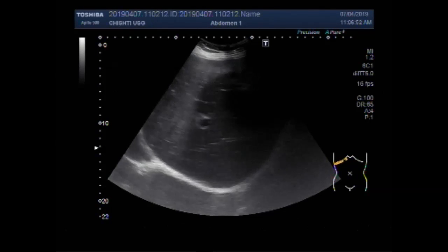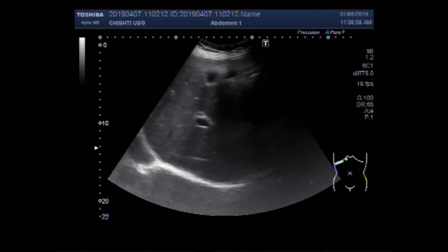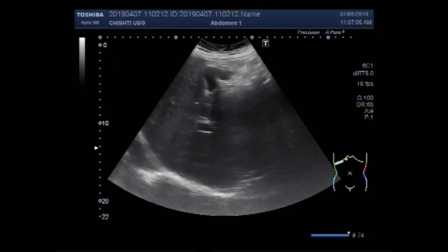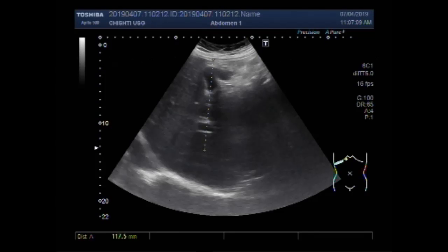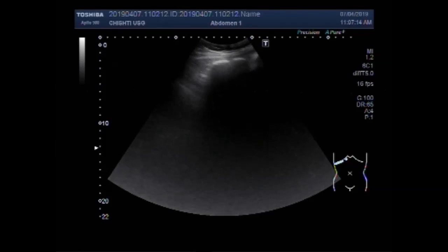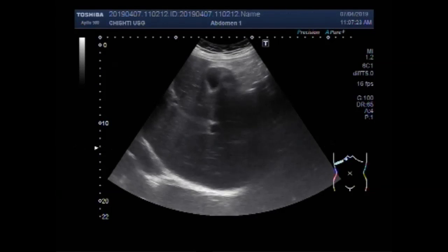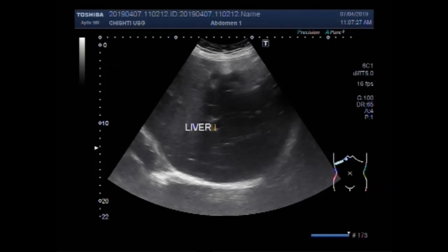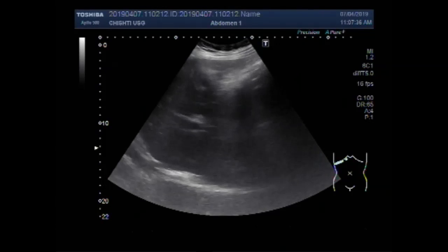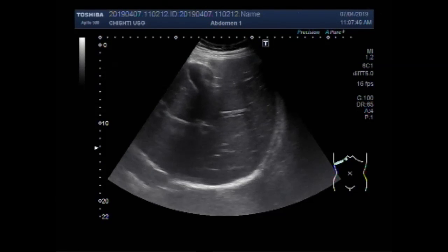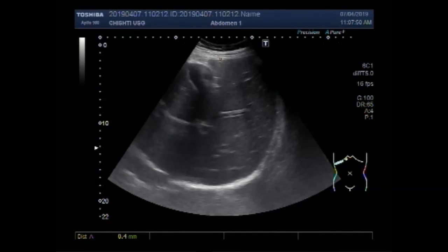Here you can see the liver and gallbladder. Again the liver and gallbladder is visible. This ultrasound video shows a large renal mass.